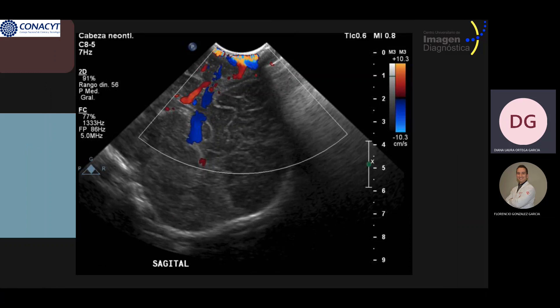This sagittal color Doppler examination shows an intracranial vascular structure with a path to the bone defect, compatible with persistent falcine sinus, which is one of the associated venous anomalies in this pathology.